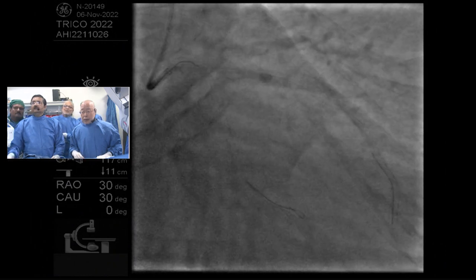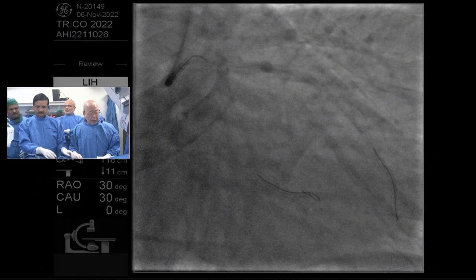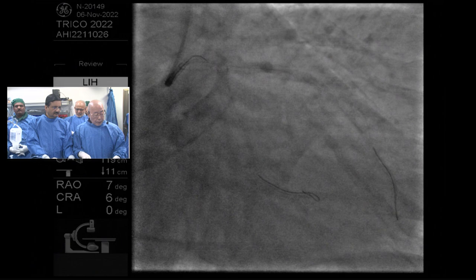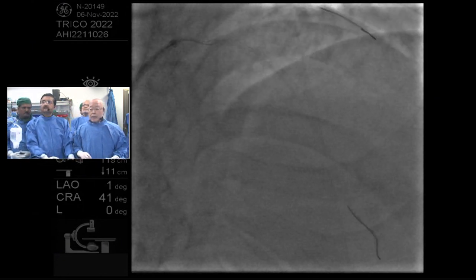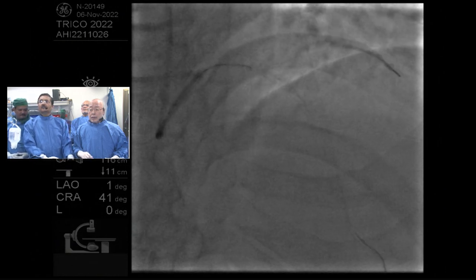It's this whole idea of luminal reserve, right? Which I think we'll hear a little bit about later, where how big is this vessel meant to be when it needs to be in its biggest conformation? Once you remove vasomotor reactivity from the vessel by putting a stent in, it's suspended in that size. So you better suspend it in the biggest size it can be.